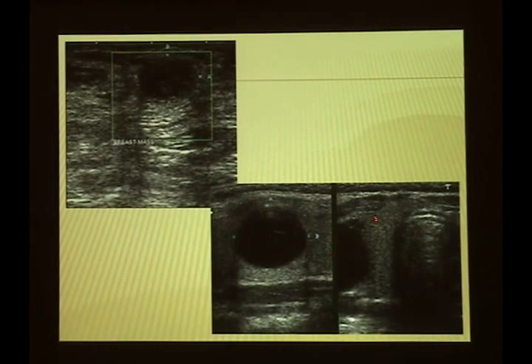Now we are in the thyroid, and in the right lobe of the thyroid, again there is an anechoic, black, well circumscribed, rounded lesion, and when we look at the distal aspect of this lesion, there is a bright band, and this bright band shows that this lesion is fluid filled and is known as acoustic enhancement.